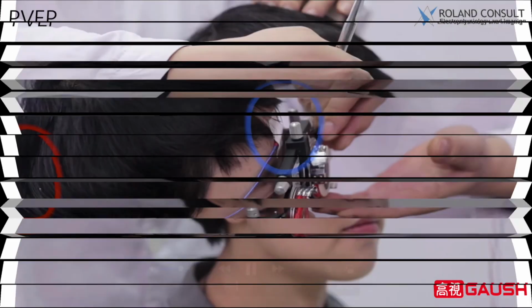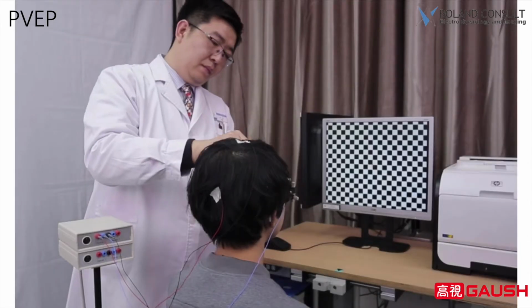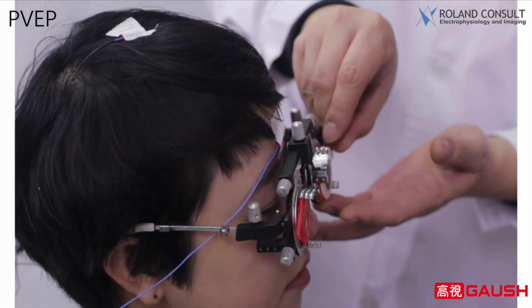Step 4. Refractive correction. The correcting lens is placed according to the best corrected visual acuity examination result at 1 meter distance. Step 5. One eye covering. Check the right eye first, then the left eye. Cover the opposite eye during a monocular examination. In general, use a black eye mask or a lens holder inserted with a black screen.